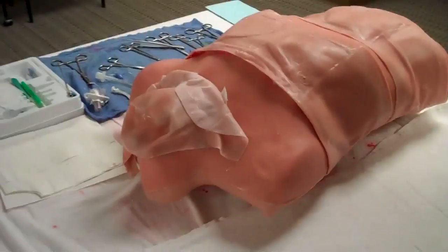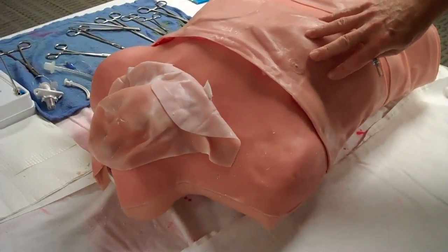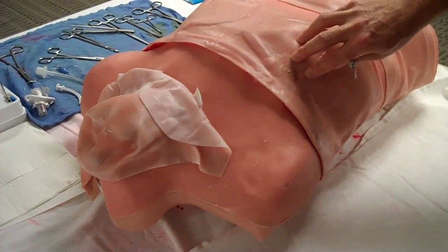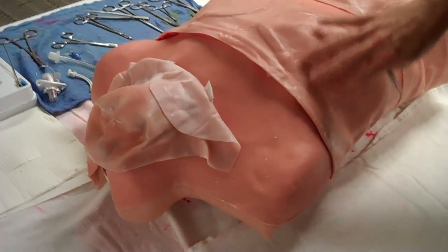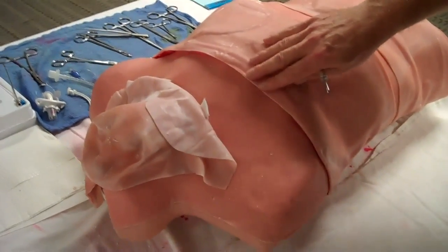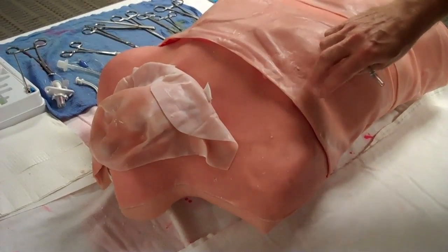We're going to switch sides here. We have a trauma mannequin, which is a demonstration unit, and it shows the chest. The optimal insertion site for this is the second intercostal space. We will pretend that this patient has a right tension pneumothorax, so we're working on the right side of the chest. First, take a moment to splash some betadine or other disinfecting solution onto the chest over the area.